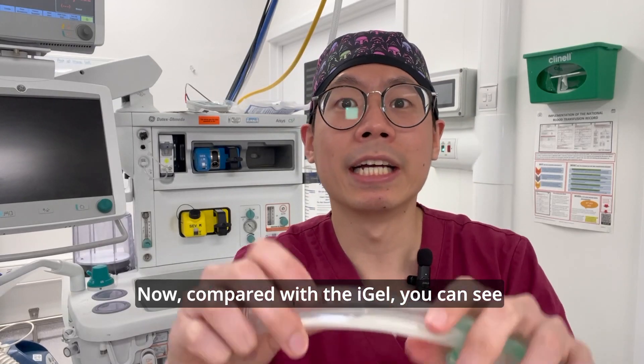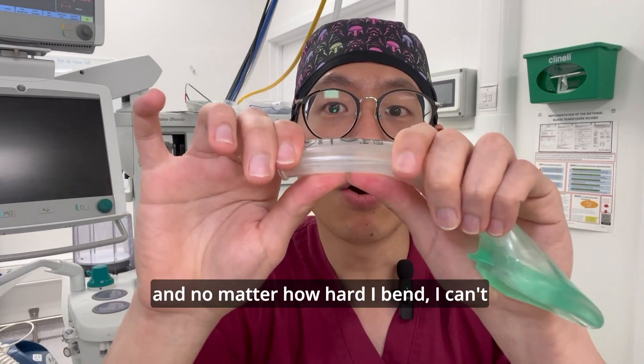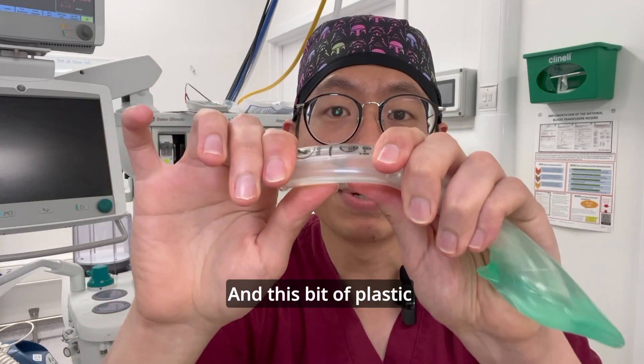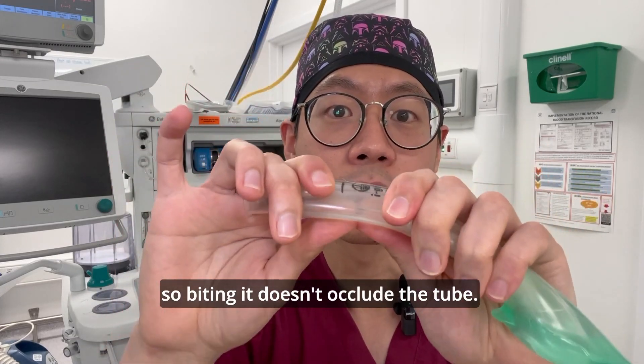When we compare that with the i-gel, you can see there's a thick block of plastic here, and no matter how hard I bend it I can't occlude the tube — as compared to the LMA. This block of plastic sits at the patient's mouth, so biting it doesn't occlude the tube.